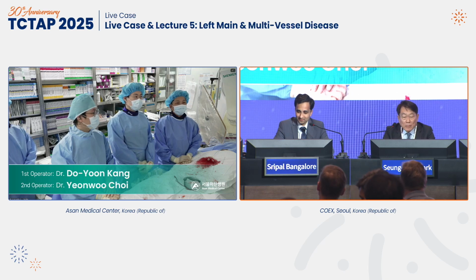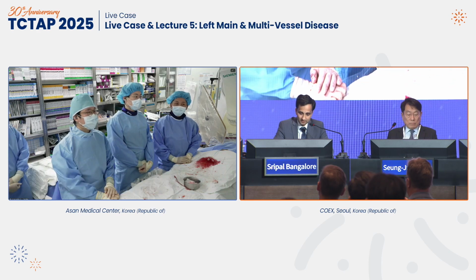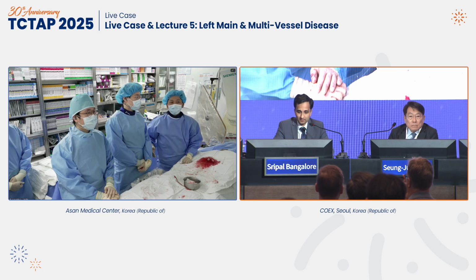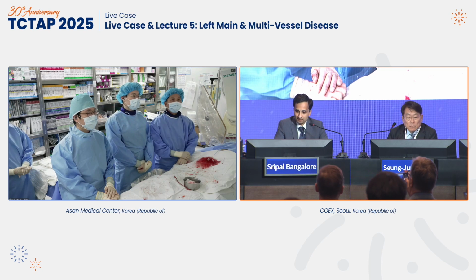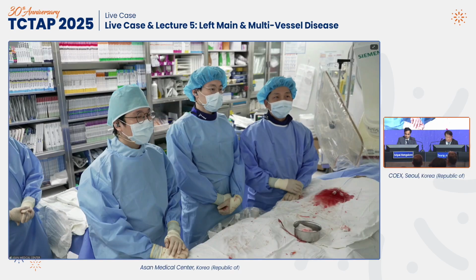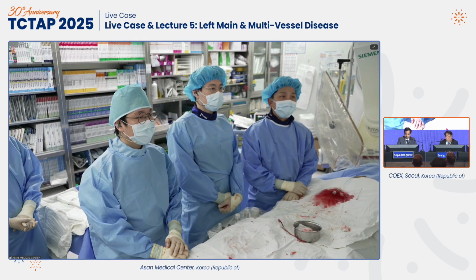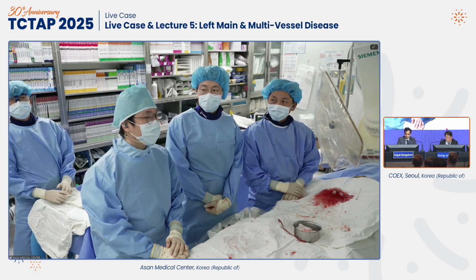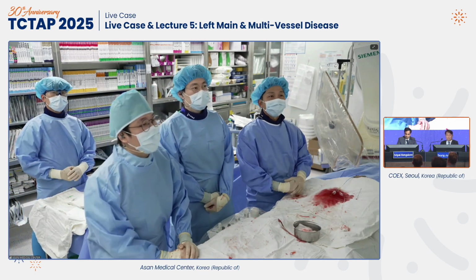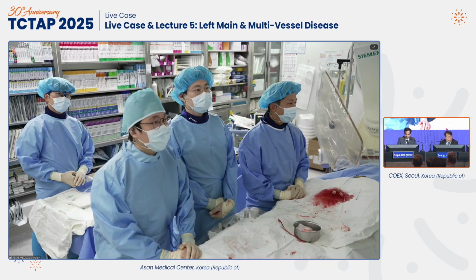It is my honor to present the live case of the left main. I am Dr. Do-Yoon Kang from Asan Medical Center, and I will introduce my team. My assistant is Yeonwoo Choi, a senior instructor, and Seung-Jung, our senior fellow of interventional cardiology. Dr. So, please present the patient case. Yes, thank you, Professor Kang. I'm Kyusup from Asan Medical Center.